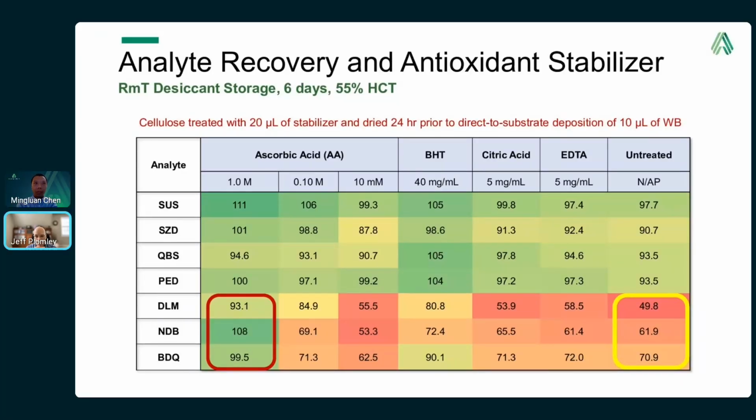And the fact that the liberation of iron from hemoglobin during air drying enables the production of hydroxy radicals through a Fenton reaction, it made sense to arrest the activity of this liberated iron.